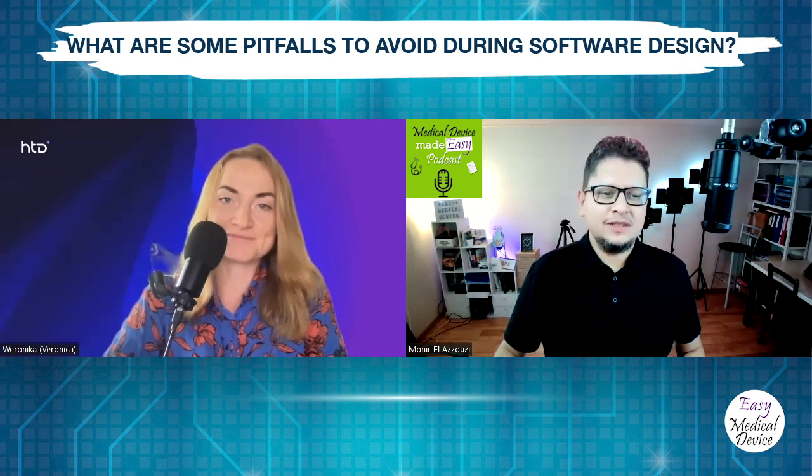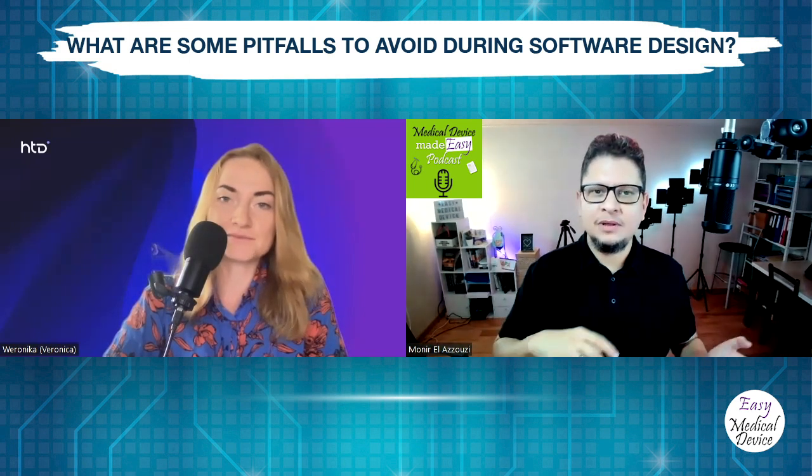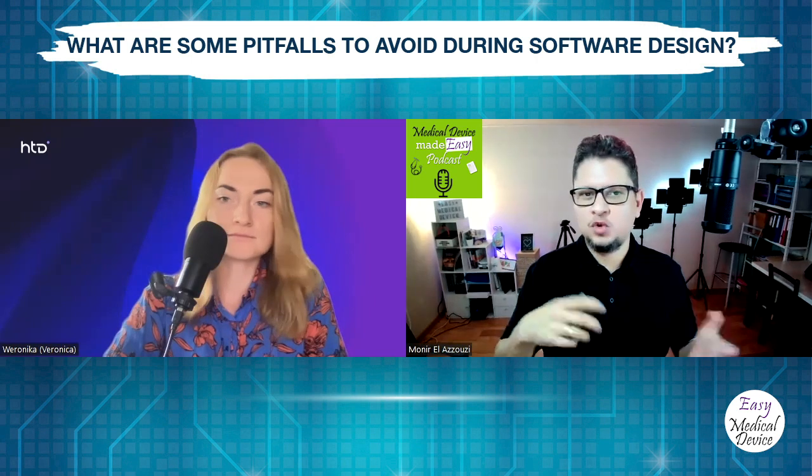No, it's not. I mean, it's always difficult to remember what happened, how it was done, and to try to create retrospective documentation. I'm not saying it's not feasible, it's just really difficult. And to be honest, it's even painful for the consultant doing that, because it's not really the normal way to go. It's like, think back: what were the user needs? What were the design inputs that you have done? What are the different modules, the architecture? And even sometimes when you ask them, they have no clue what you are talking about.